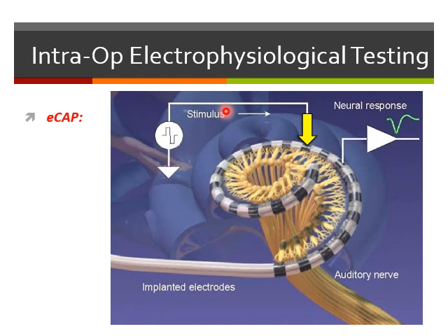This action potential can be captured by an adjacent, not immediately adjacent electrode, but after one electrode, then take the other one of the electrode. For example, if I give the current at the 5th electrode, I can capture the ECAP from the 7th electrode or from the 3rd electrode, not the immediately adjacent electrode. Now, when I capture the ECAP from the other electrode, I will have this picture. This will represent the ECAP of the measured action potential.